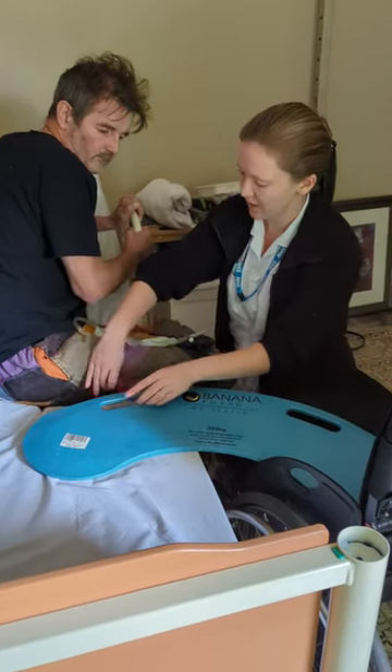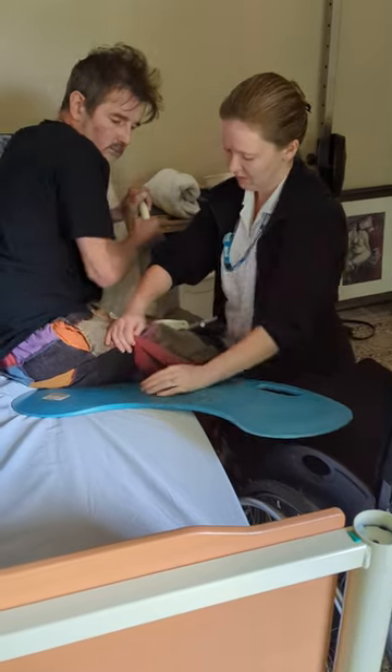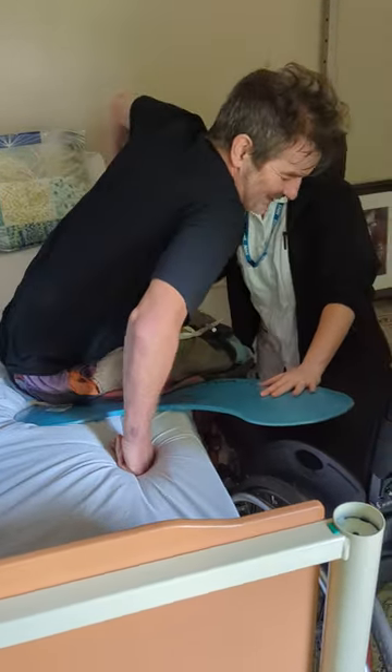The bed is higher than the wheelchair. Lift the trousers, tucking under, and then when you're ready, don't put your fingers under the edge — just guide me across.